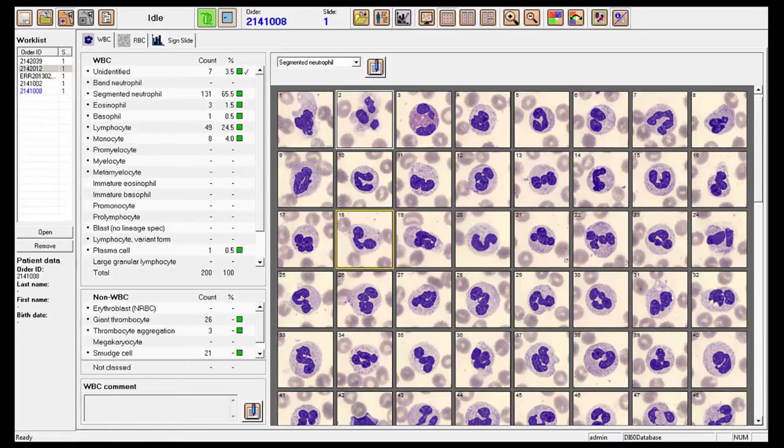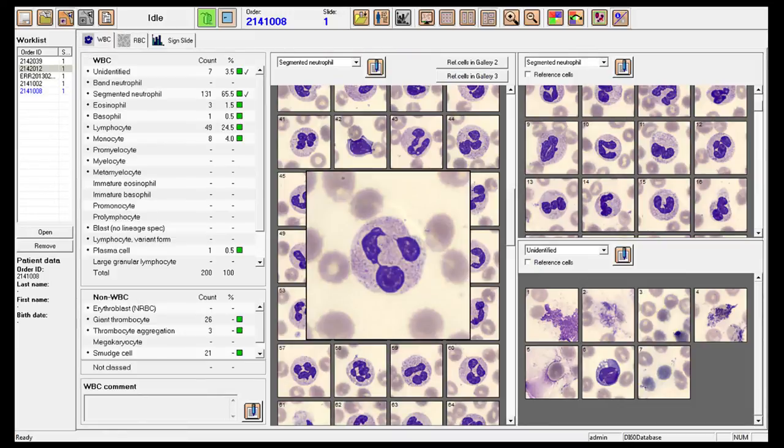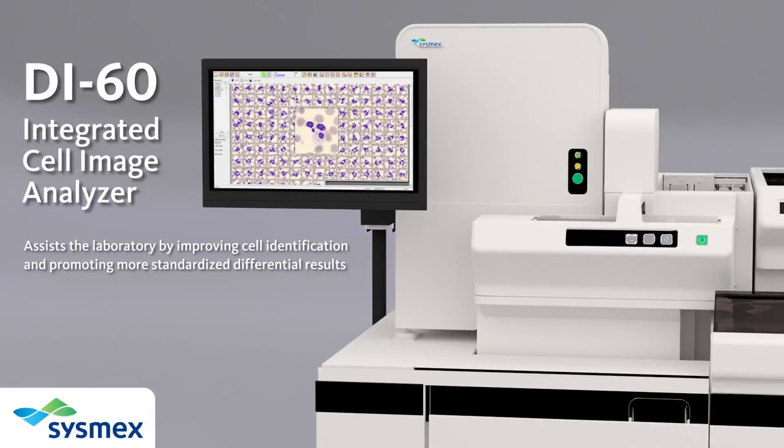Cells are photographed, pre-classified, and presented on screen for easy review and validation by the staff. The system can assist in automating WBC differentials, RBC characterization, and platelet estimates. The DI60 will assist the laboratory by improving cell identification and promoting more standardized differential results.